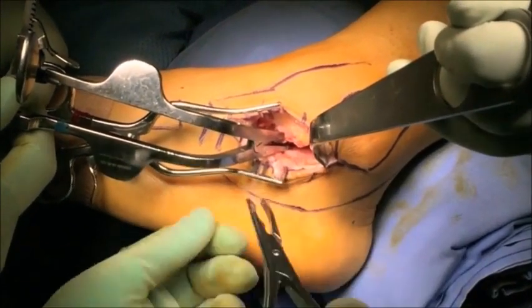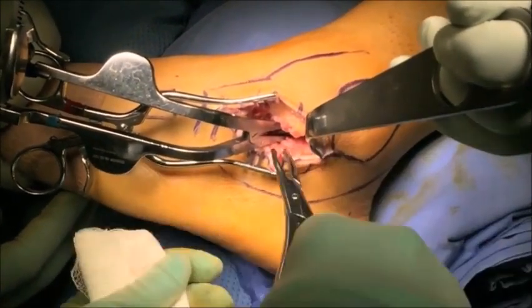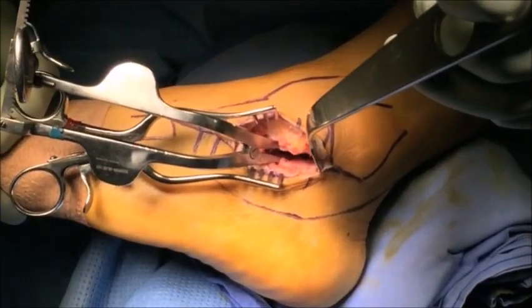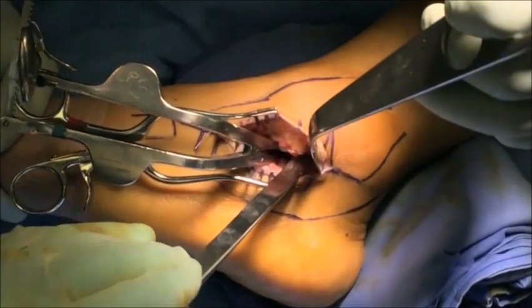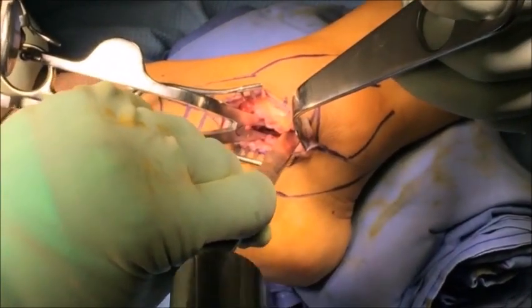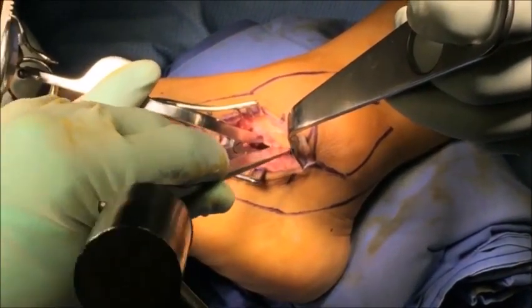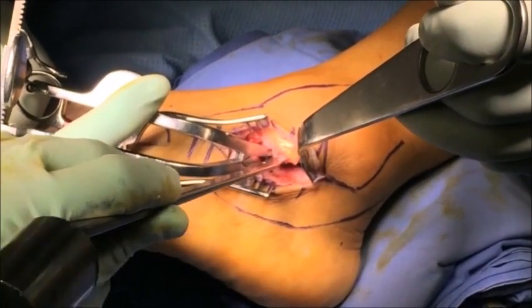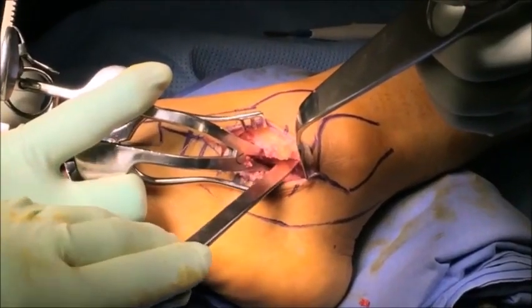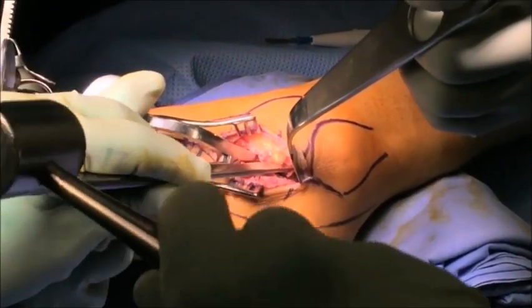It is important to meticulously remove all debris from inside the joint. With good visualization of the posterior facet, the osteotome or chisel is now used to denude the remaining cartilage and remove any sclerotic bone from the joint surfaces. It is important to get down to healthy bleeding subchondral bone. Take your time in preparing the joint surfaces as this is a critical part of achieving a successful fusion.